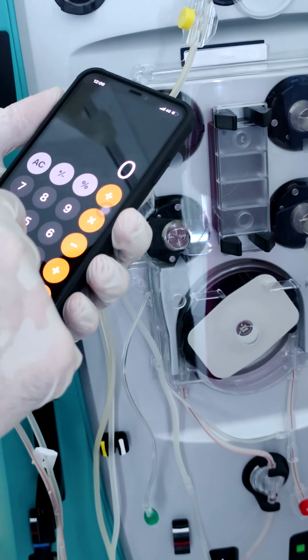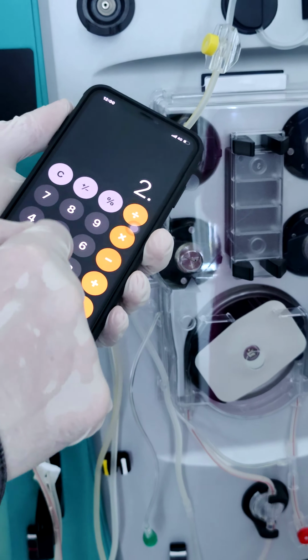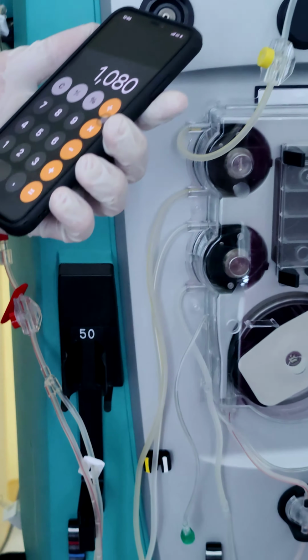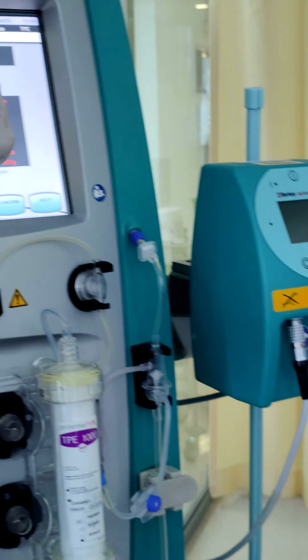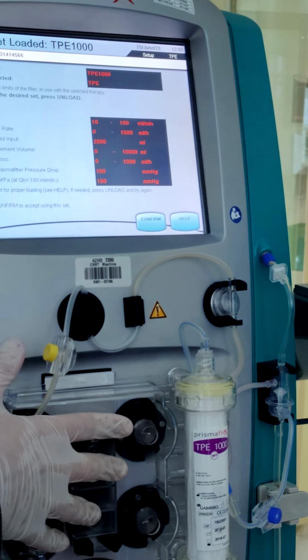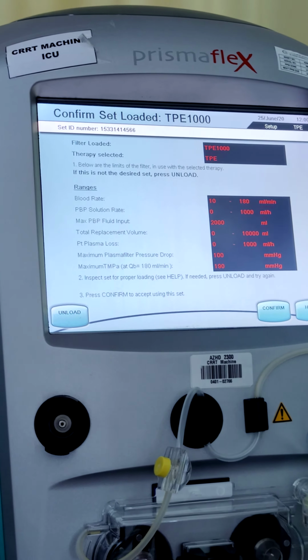2,700 divided by 2.5. Approximately 1,000 per hour. Right. This is our TPE 1000. This is the limit of the filter. It's the default on the machine, just to confirm.